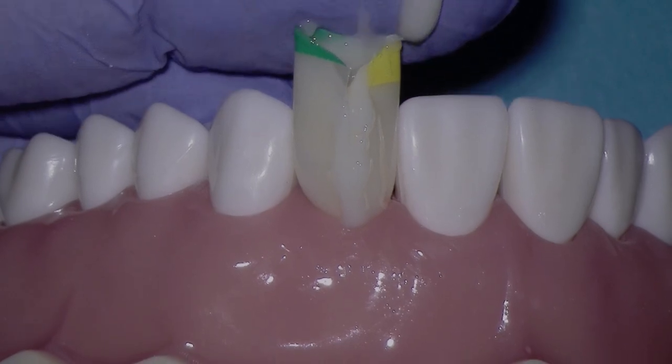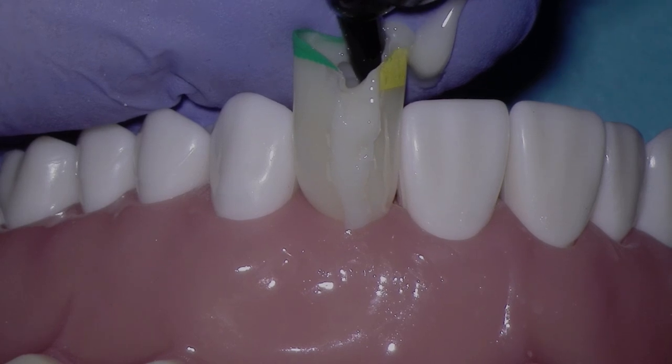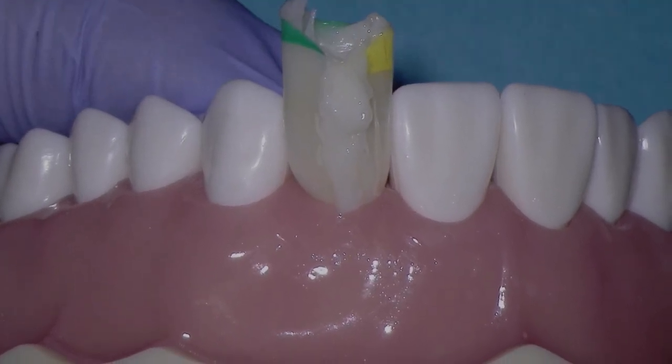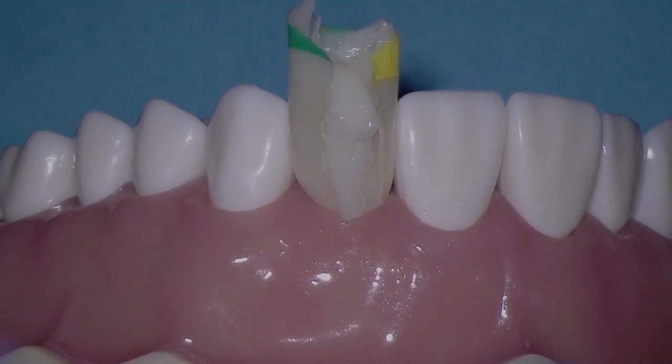Now, if it's a very large tooth, you can actually pump in a third compule of paste composite. Your job when you're injecting the paste composite is to displace most of the flowable composite, just like using light body and heavy body.